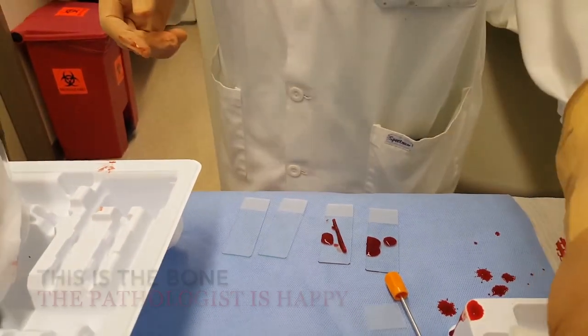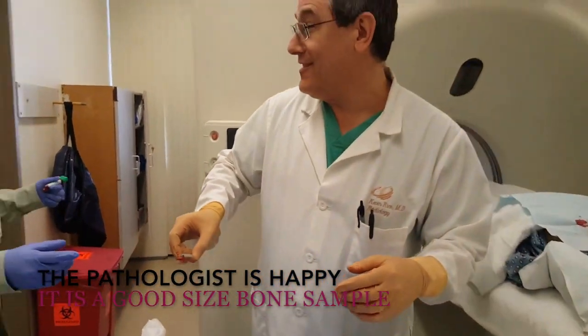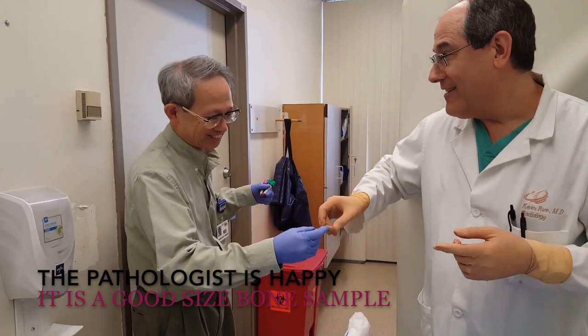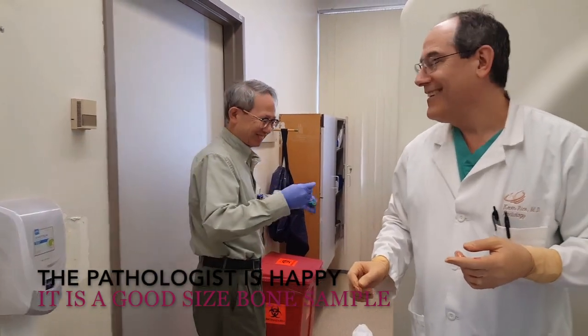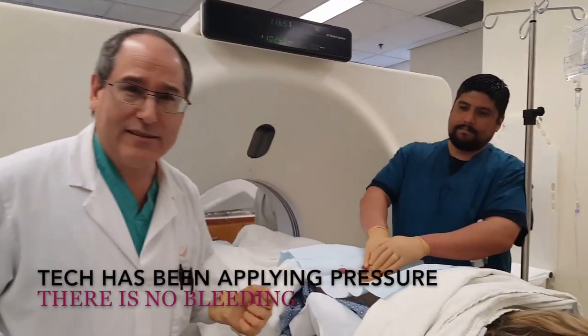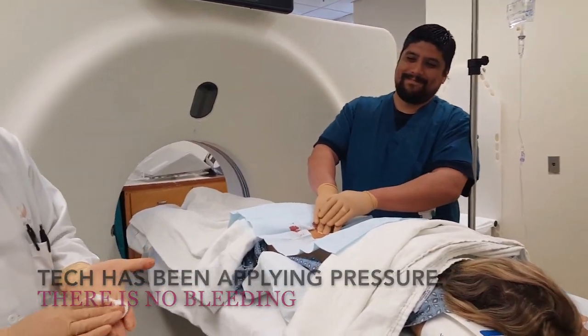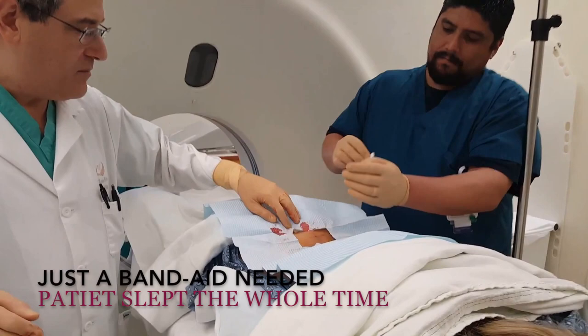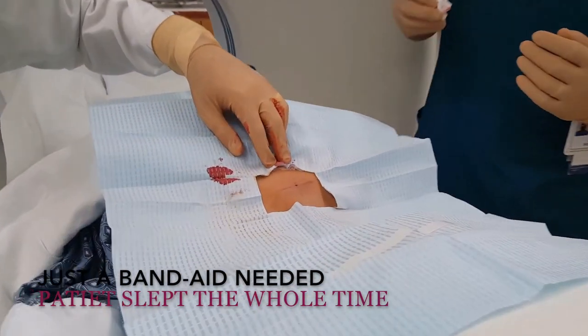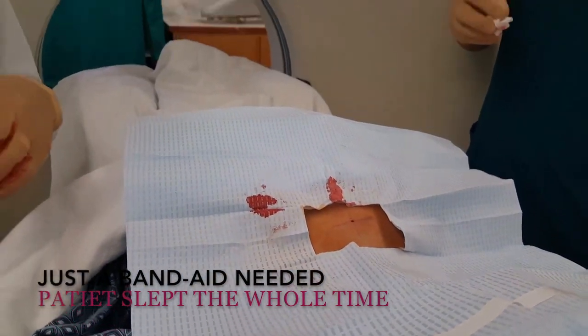So a great specimen there — I'm very happy. How happy is our pathologist? And the patient's happy. We've got our tech David here putting some pressure on the site for the last few minutes. It's a biopsy site now, so it just needs a band-aid and we'll be all set.